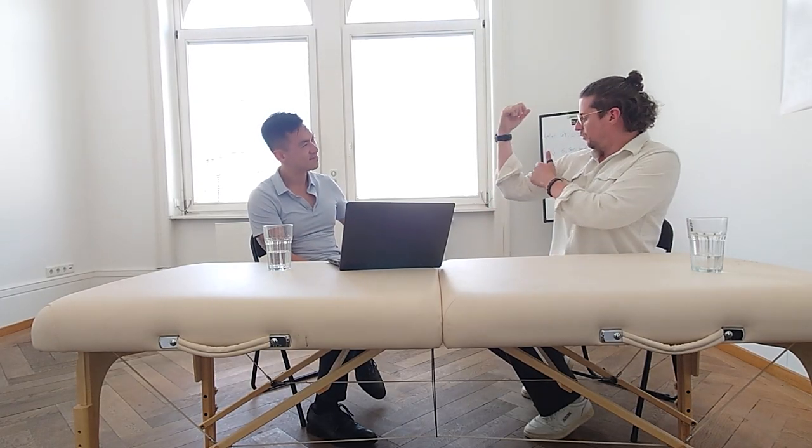Well, it's the balance score, basically, that's the main thing. Well, we also have the MVAs, the so-called maximum voluntary activation. It's a bit correlating to the MVC, you know, from normalization. So we don't use, in this case, a resistance you are not able to overcome. We use the body at the end of range of an ankle or a joint. So for example, when I want to do an MVA for the biceps, it's like going to the point where you can't go further and then activating it as high as you can. Or like shrugging your shoulders as high as you can. Put them down as much as you can.